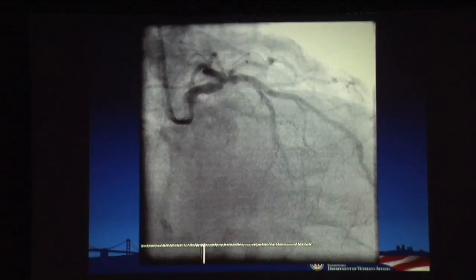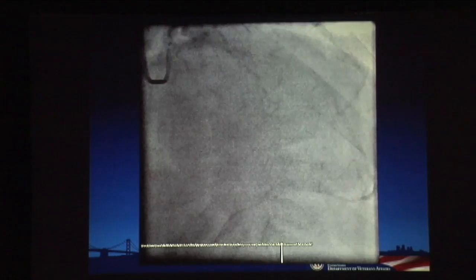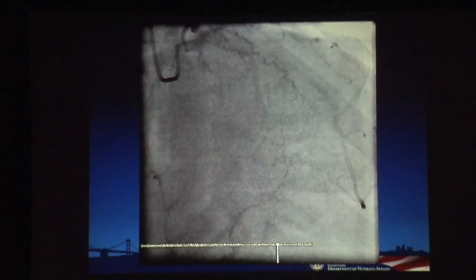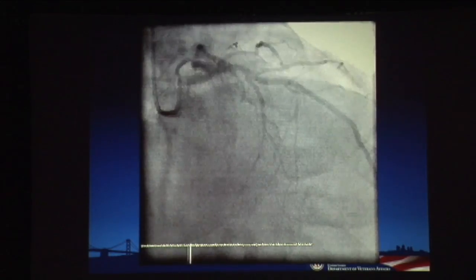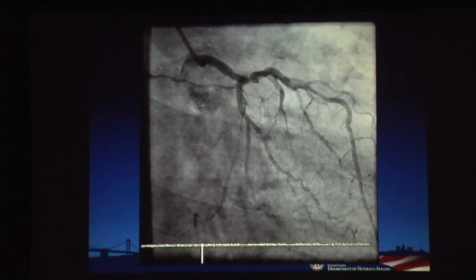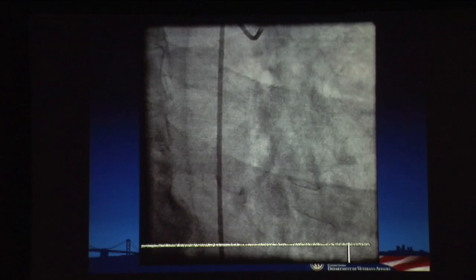Some more views here, an RAO cranial, to try to identify the severity of that distal left main and proximal LAD, and it looks a little bit borderline. And again, you see some collaterals going to the inferior wall. Again, in this view, you see the vessels quivering from the AFib. You see some collaterals to the right, and at that proximal LAD, there's a haziness there. There's almost a shelf lesion.